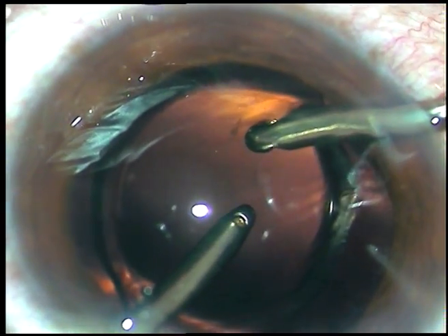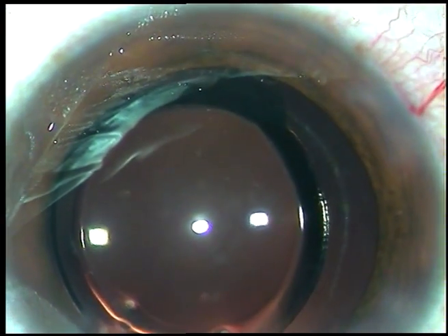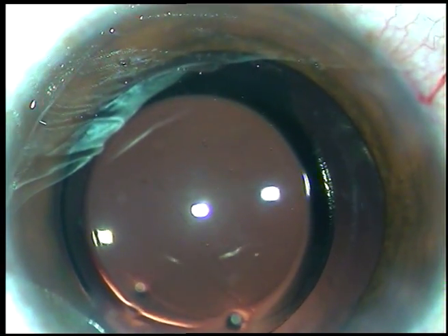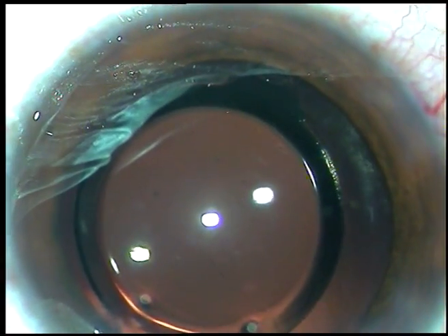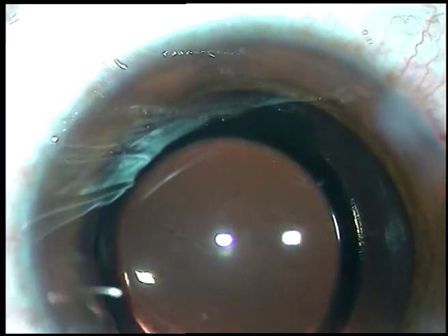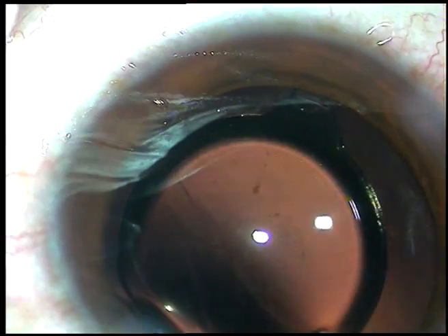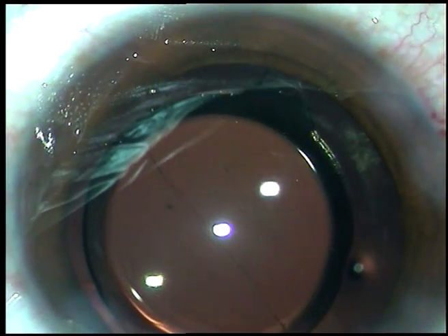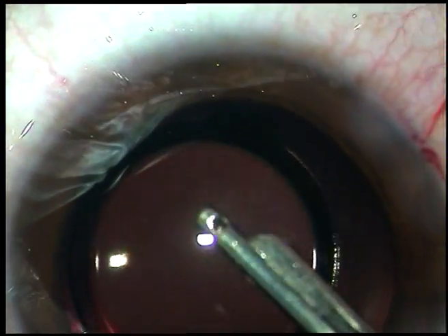If you want to see the happy face of a patient the next day and good vision in the early postoperative period, remove all the viscoelastic substance. Now, the side ports are hydrated with BSS. The stroma on either side of the clear corneal incisions is hydrated with BSS so that these incisions close and become watertight. My main incision is constructed in such a way that it doesn't need hydration most of the time.